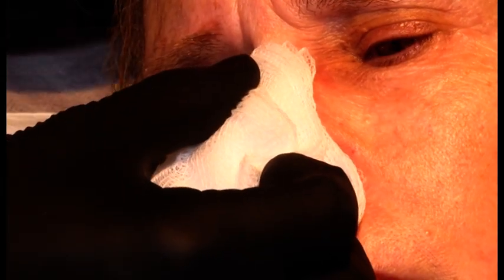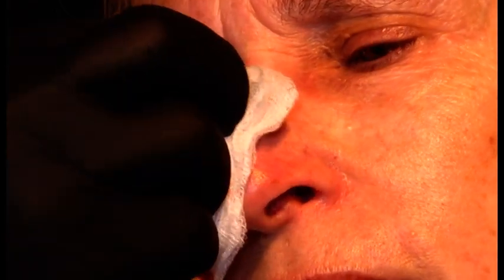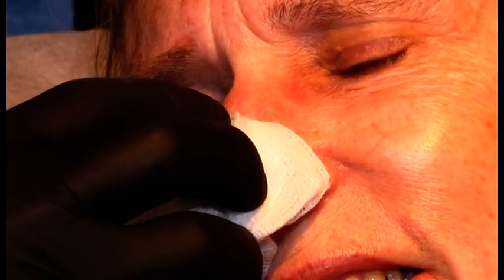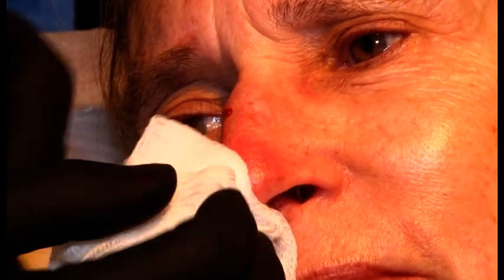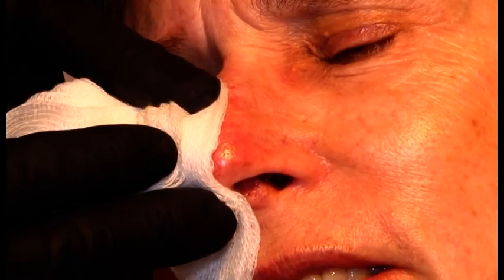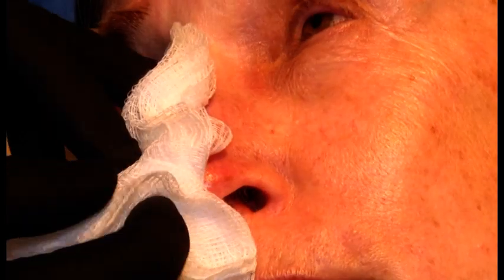I suspect her of having had a glass of wine before the show. What do you think? She did. Oh. No, you didn't? Oh, okay, good. Did you take any anticoagulants today? No. No? Okay, maybe you just have a lot of blood. Royal blood. Do the other side afterwards, right?